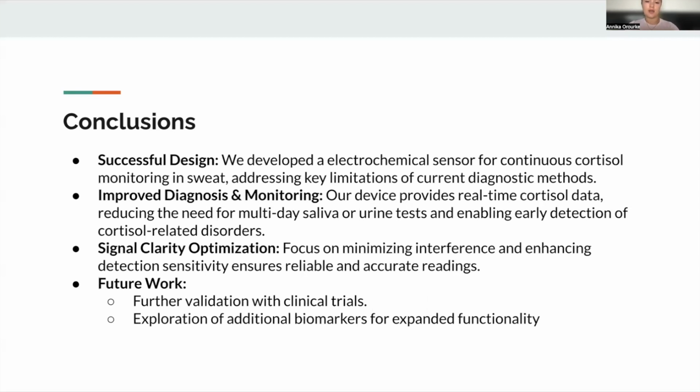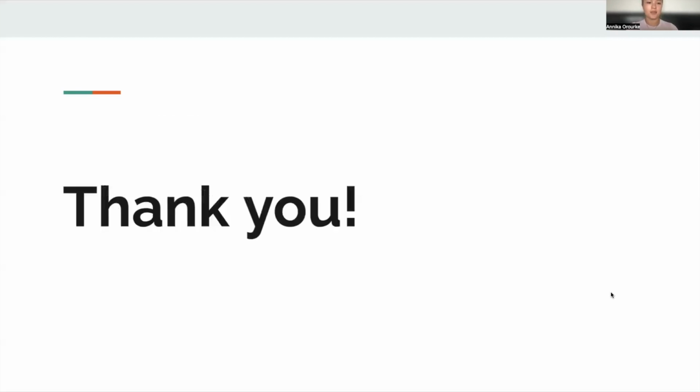And some conclusions: our device design was successful because of the simulations. Our device has a better process of diagnosing these cortisol-related disorders because there's no need for a multi-day saliva or urine test. Our device focused on signal clarity, which we achieved, and for further work, we could create and test our cortisol sensor on ourselves or in clinical trials, and we can explore using our cortisol sensor in addition to other biomarkers for expanded functionality. Thank you.